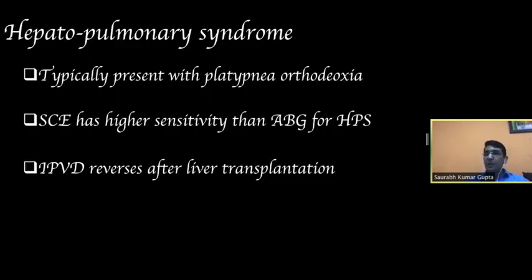Now, this typically presents with platypnea or orthodeoxia. No presentation on saline contrast echocardiography can be complete without bringing in this term. In this condition, the patient becomes hypoxic when standing. So in all such cases where they document or demonstrate hypoxia on standing, it is a good idea to do saline contrast echocardiography in a standing position, and it has been shown that it increases the sensitivity of picking up intrapulmonary shunts in cases which cause platypnea or orthodeoxia.